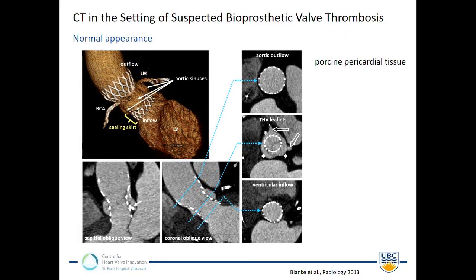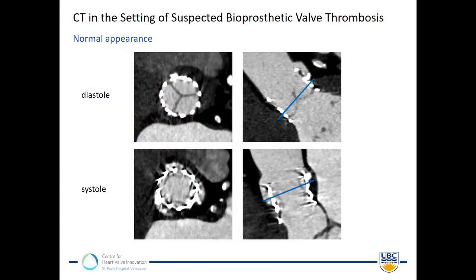These are images of a CoreValve. Typically here is that the leaflets appear thinner than in the Sapien valve, sometimes actually very faintly and difficult to visualize. Most importantly, when you're looking at those images is that you want to have a symmetric appearance of all leaflets, and I always compare that with brain imaging on a brain CT. If you don't know whether something is abnormal, you always have a second side, the other side to compare it to. And if the finding is symmetric, it's rarely abnormal or not an acute finding. That is, I think, also what pertains to those valves.